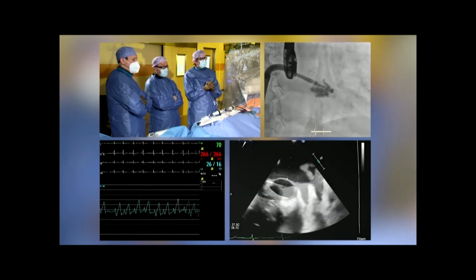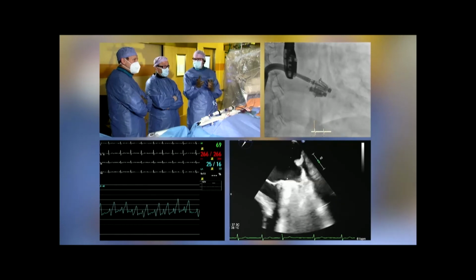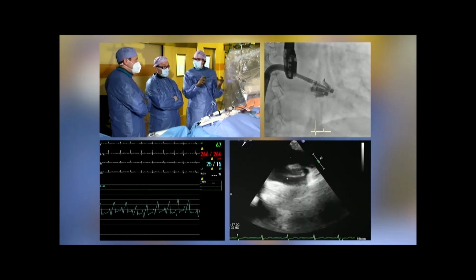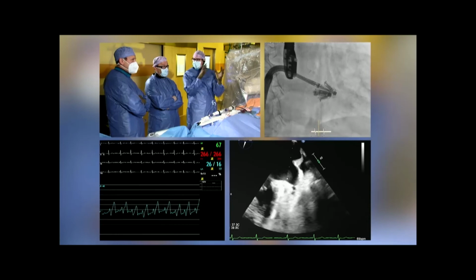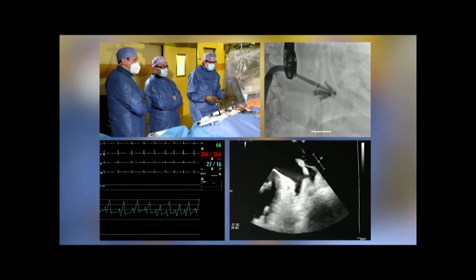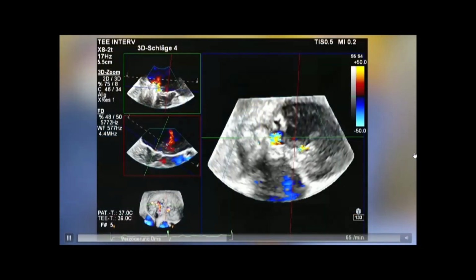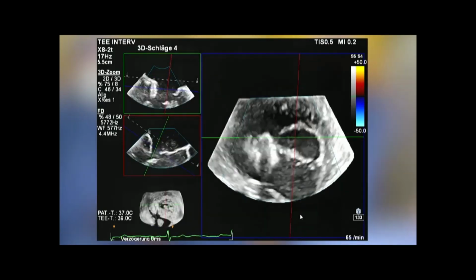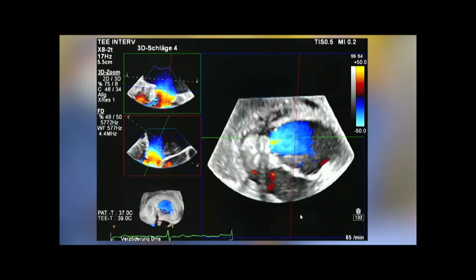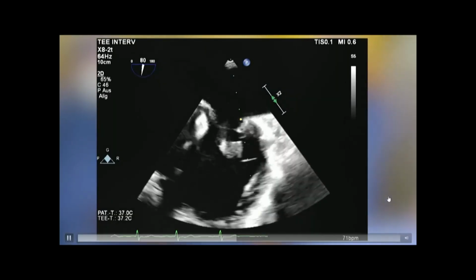And here, my impression was that we have no distortion. We restored the natural anatomy away from the site of implantation, obviously. So all of these things should be included in your assessment. So you see that is really traced. So it's 1 millimeter vena contracta and biplane both. So I would say that is really traced to grade 1 maybe.